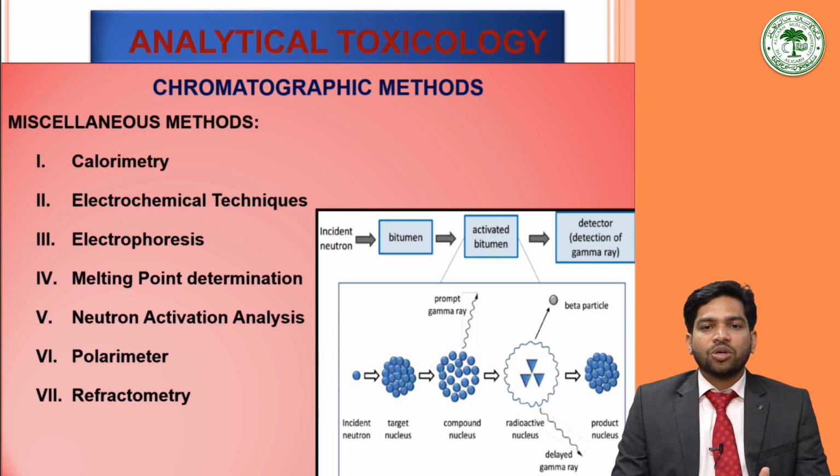The sample must be reduced to the atomic level, that is atomized, for this analysis. Atomization is done by breaking the chemical bonds and releasing the individual atoms. This is done by increasing the temperature of the sample. Analysis of the energy of the emissions can reveal the identity of the element originally present in the sample. This analysis is done by placing the irradiated sample into a counter system capable of detecting and recording the specific radiations, in neutron activation analysis.